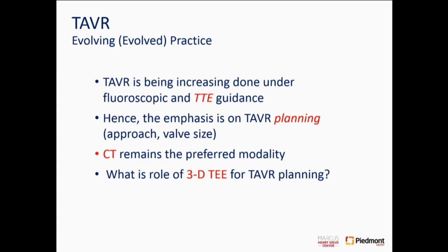Most of these patients who cannot have contrast CT because of elevated creatinine in our center now get a 3D TEE for annular sizing and TAVR planning. This is a precious technique because these patients don't have an alternative way of doing annular sizing.